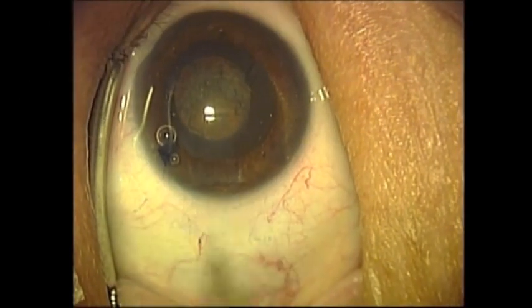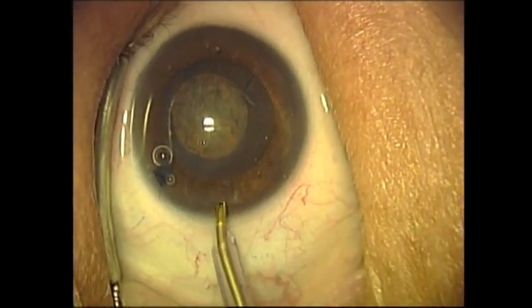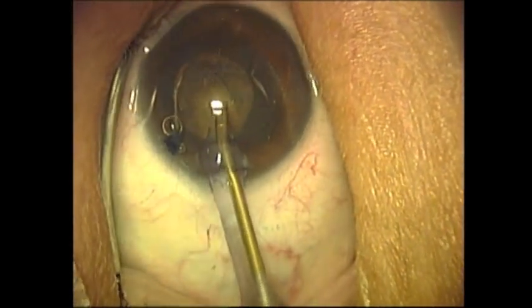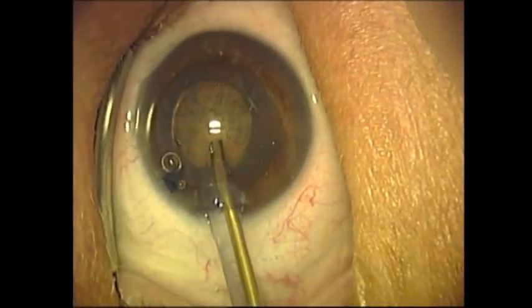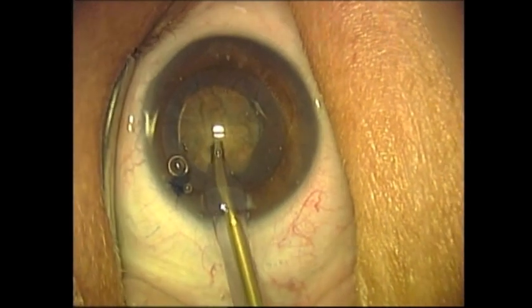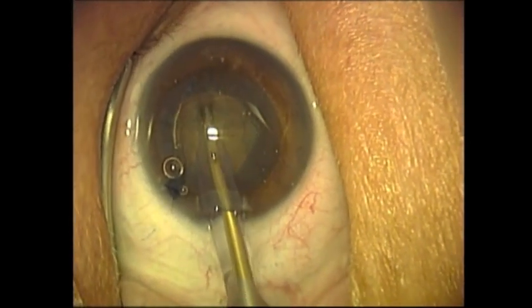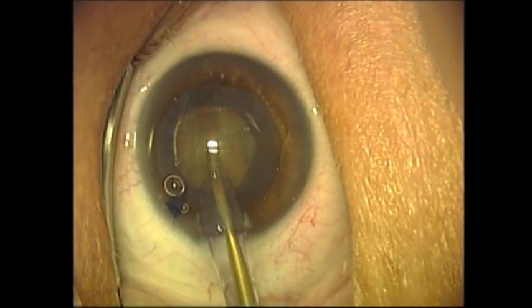A capsulotomy has been performed, facilitated with Vision Blue. You will notice the clear sleeve on the Vacoemulsification Tip, which allows for better visualization. A vertical groove is now performed.